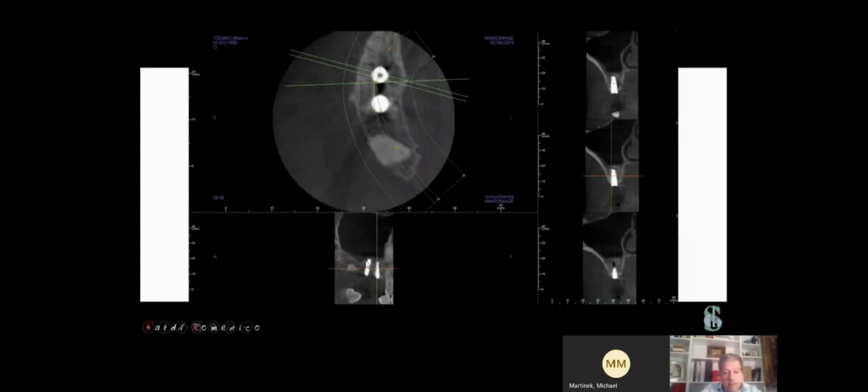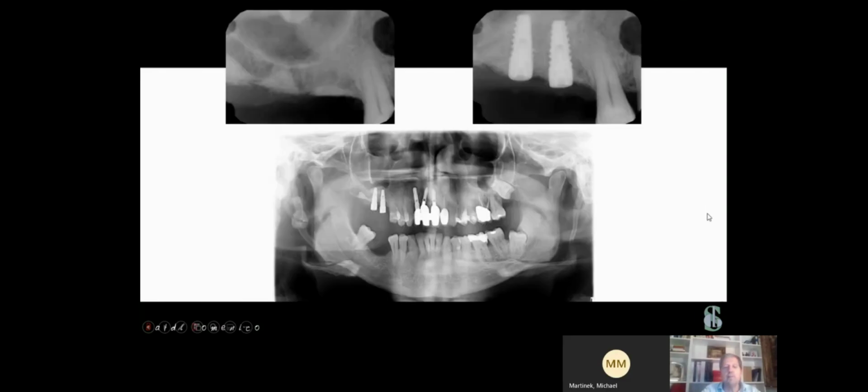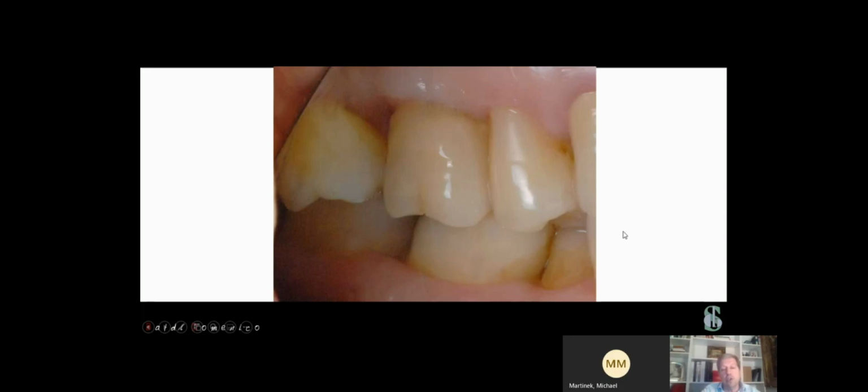You see how it's possible to obtain this kind of design. And so you can understand how it's possible to pass from here, where we can really see a very difficult situation, to here after our surgery, only by using the right instrument. So you can see again the final result. You can see here how much bone we obtained in this case using the magnetic mallet. And so we finished our surgery in a good way.